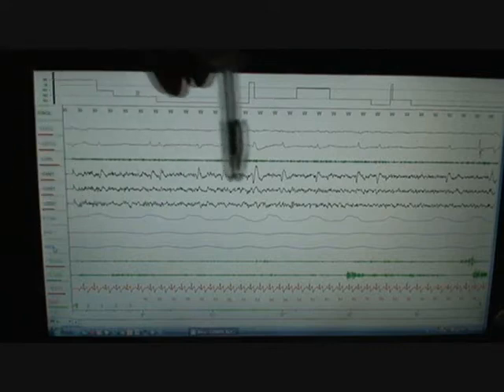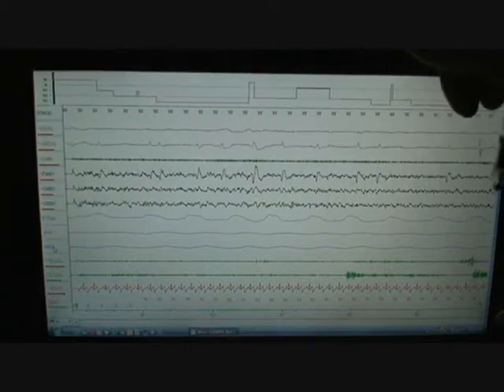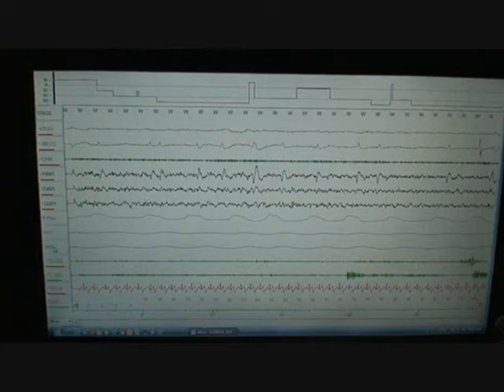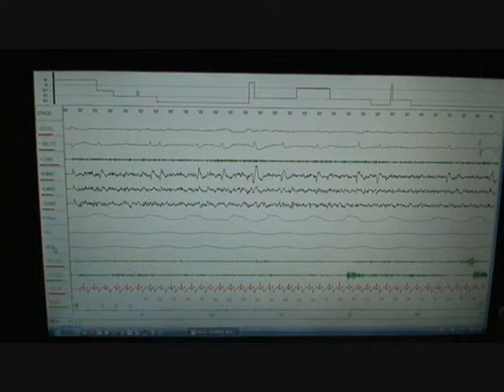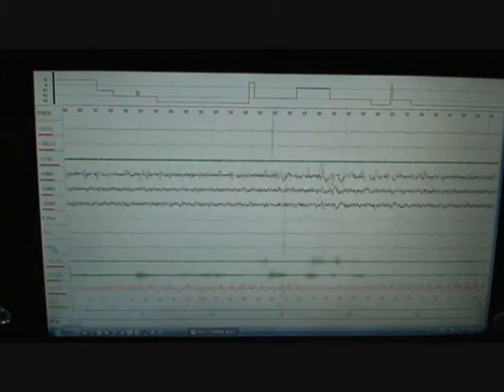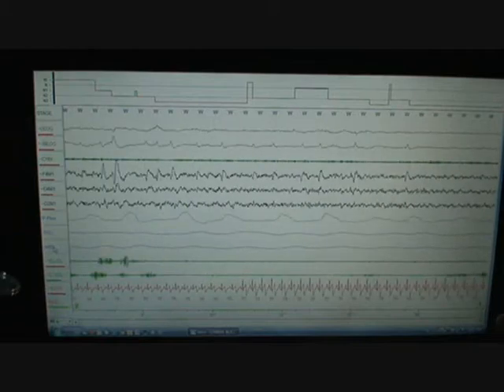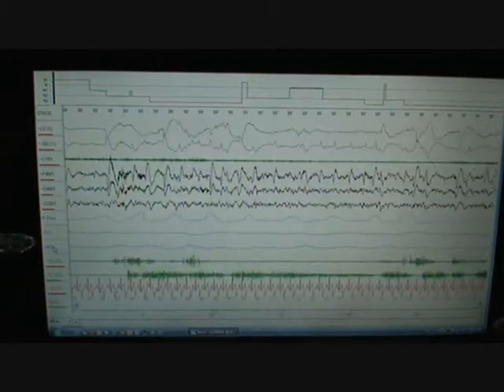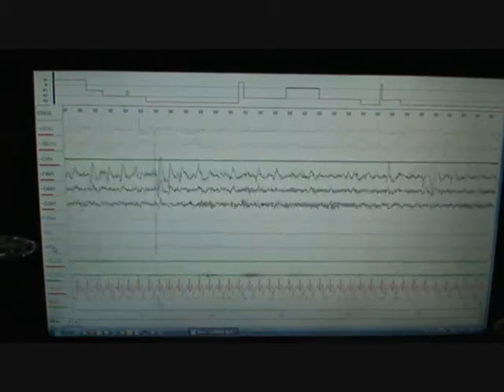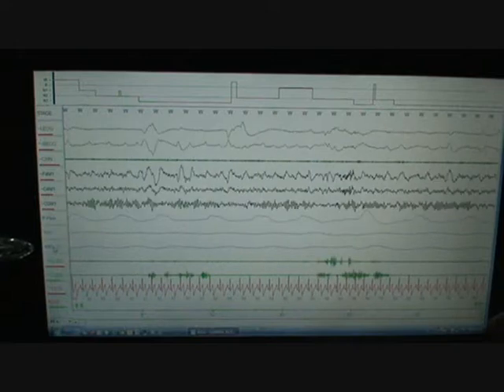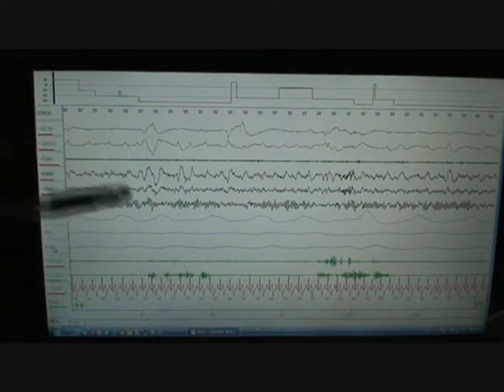So this entire page from here to here is going to be 30 seconds. What that represents, the lingo is, it's an epoch. So one epoch is 30 seconds. Two epochs is one minute. So right now we're looking at a 30 second page or one epoch.